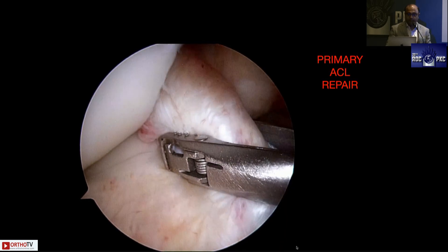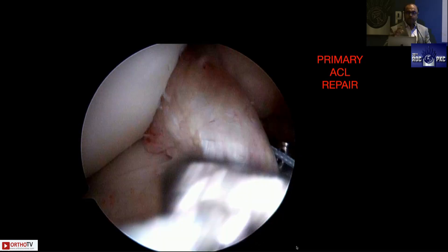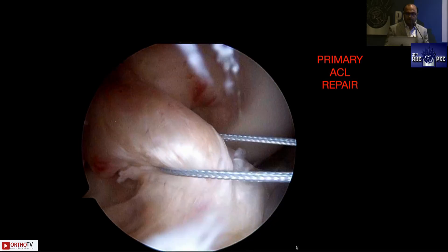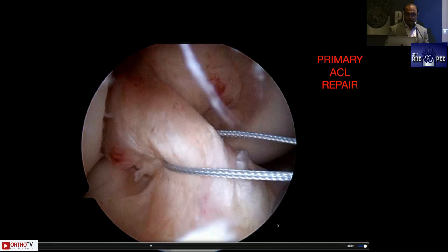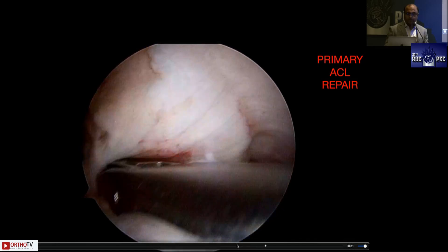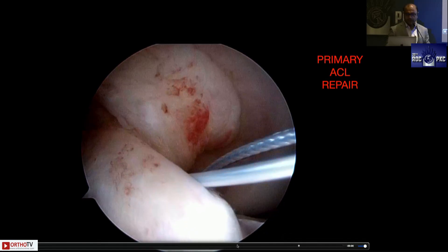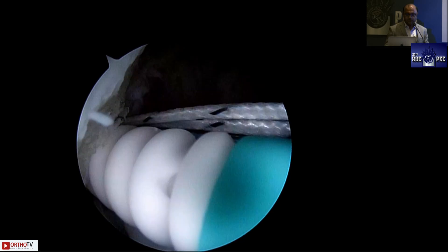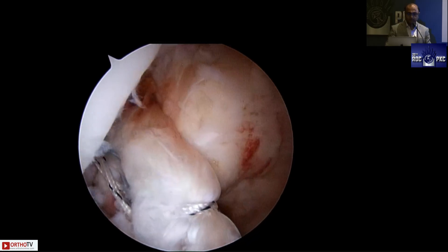For primary ACL repair, you can use the shoulder scorpion literally like a needle holder — take a fiber wire and place multiple sutures across the ACL stump, securing it to a Nautilus SwiveLock anchor for a primary ACL repair in Sherman type one ACL tears. You can take multiple passes incorporating both the posterolateral bundle fibers and the anteromedial bundle fibers, using two SwiveLocks or a single SwiveLock in various configurations. In my practice this is usually reserved for multi-ligament injuries and low-demand individuals.